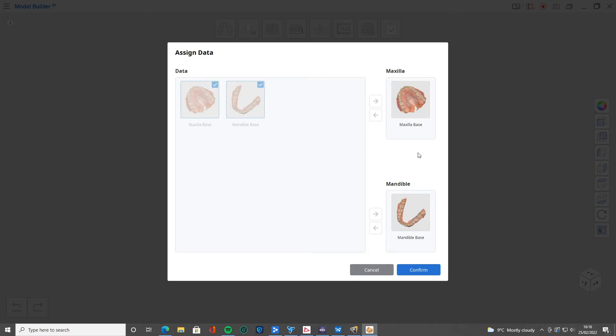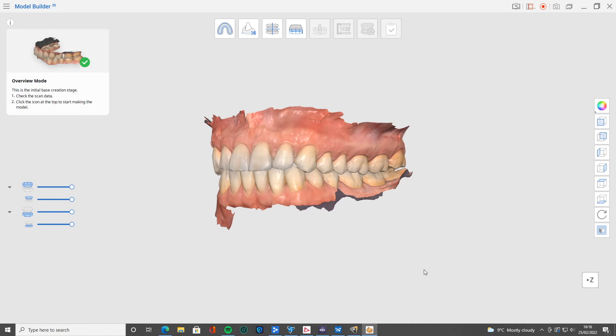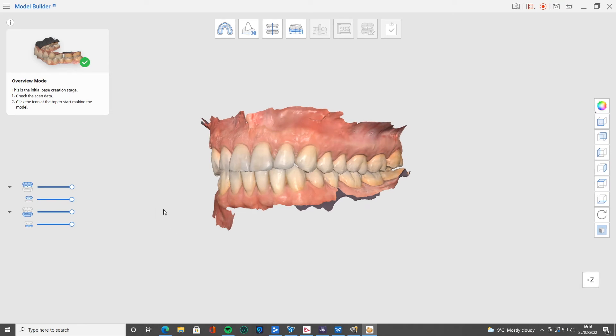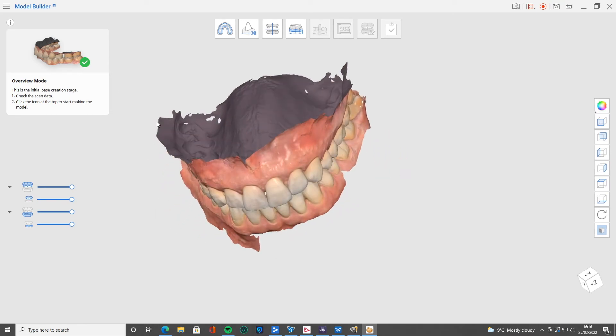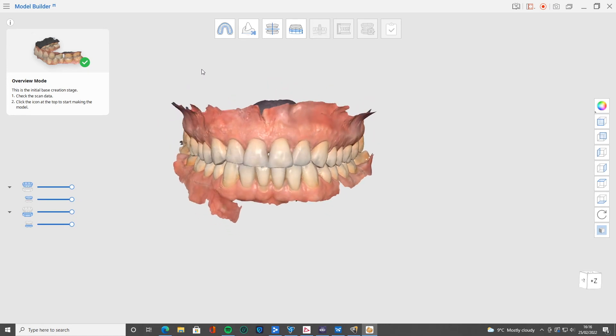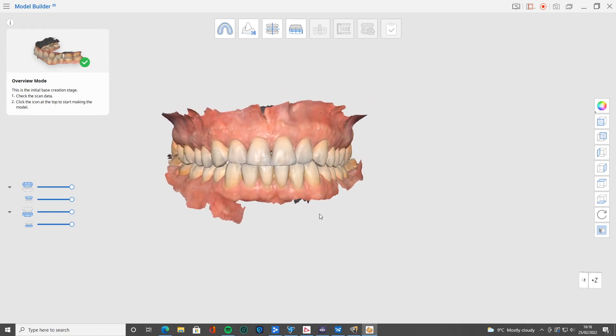And this is the overview here. You can see we've got this nice scan. An error that we see quite often in the 3D printing groups is that people try and print their scans just as they are.